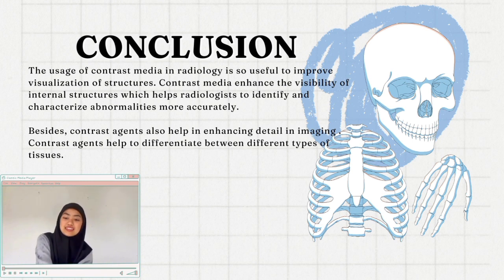And besides that, contrast agents also help in enhancing detail in images. Contrast agents help to differentiate between different types of tissues. This is particularly useful in complex areas such as the brain, heart, and gastrointestinal tract, where fine details are crucial for accurate assessment.